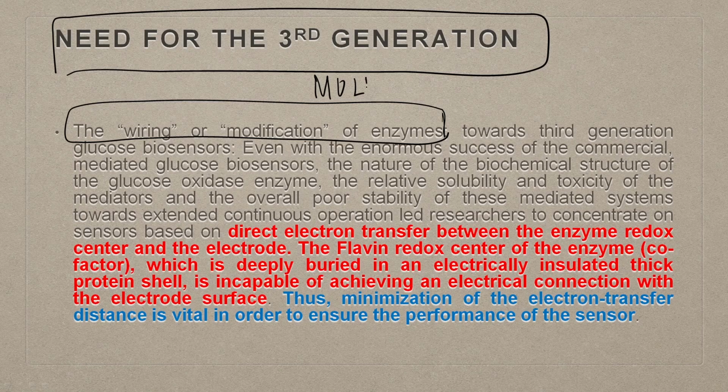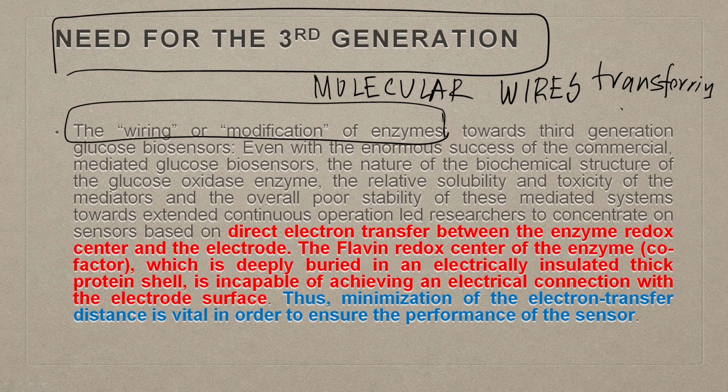The whole concept brings us to molecular wires transferring electrons towards the third generation glucose biosensors. Even with the enormous success of the commercially mediated glucose biosensors, there were issues with the nature of the biochemical structure of the glucose oxidase enzyme and the relative solubility and toxicity of the mediators.